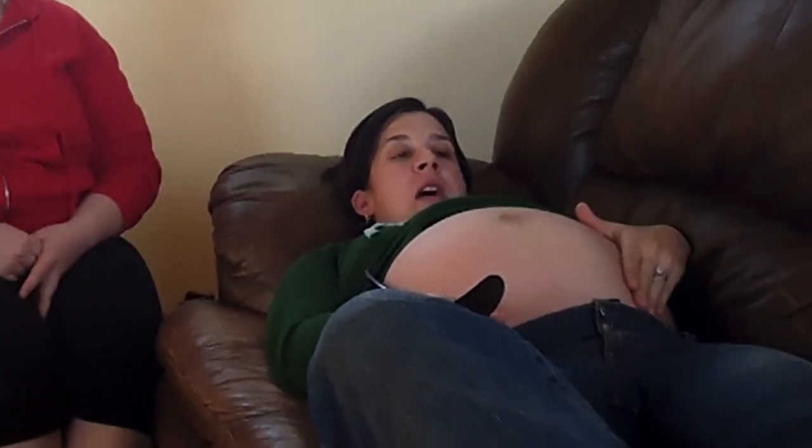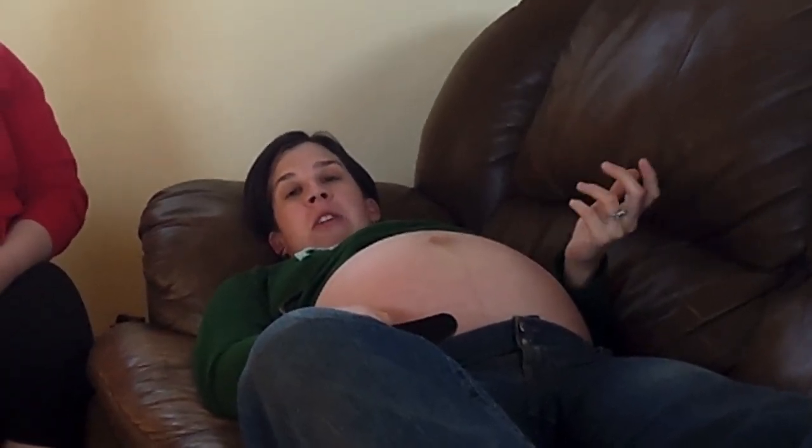Anything to add? Is there anything you can determine or guess based on where you're hearing your baby's heartbeat? What do you mean? Like, would it be different if you were hearing it up here versus down here? I think just some subtleties of position if you're really into exactly how your baby's lying. At any given moment, the back might be more forward facing, or it might be over here. A baby that's posterior and has its back towards your back, usually you'll hear those heart tones best in the center of your belly, possibly to either side. And those won't be as clear and strong just because you're not over the shoulder, you're over the chest, and it's through a bunch of layers. So again, it can be really helpful in determining position, but that would be something that you care about for some reason, and there's not necessarily a reason to care.